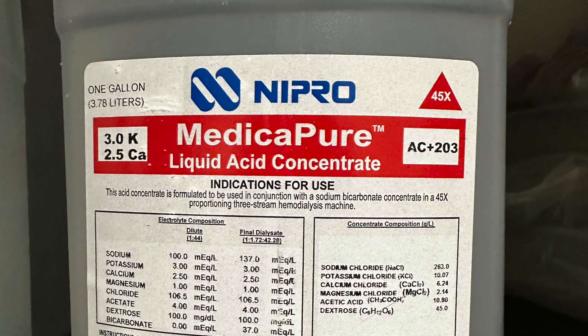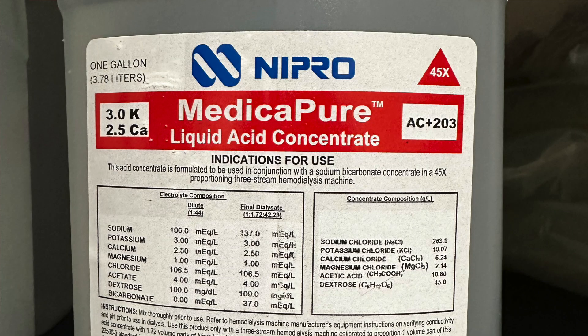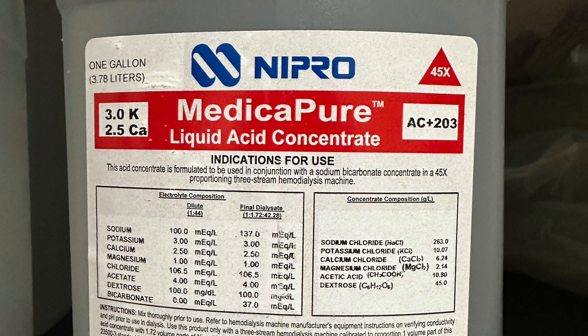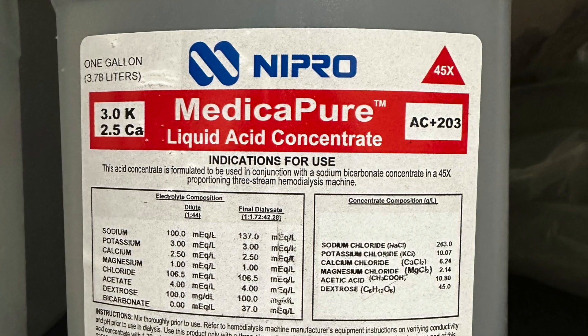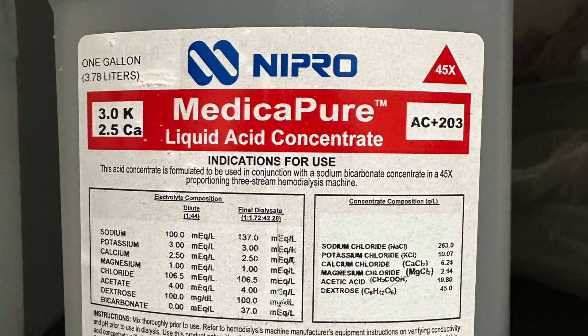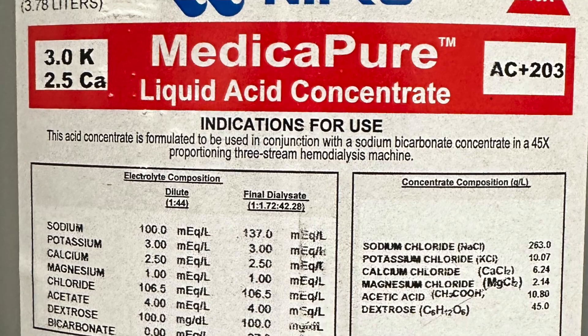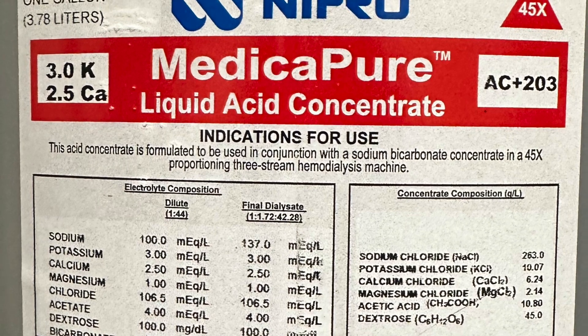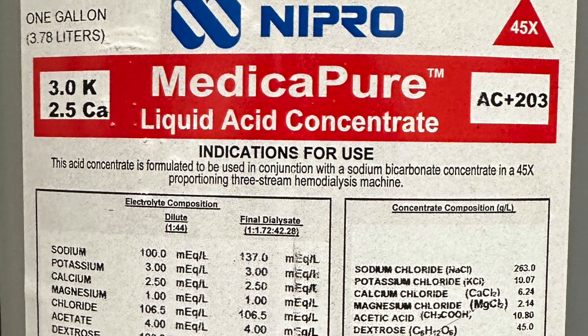The top left says one gallon or 3.7 liters. My initial thought is how does one gallon last through a whole dialysis treatment when we're doing 600 mils per minute? We'll find our answers as we go on. Next: 45X — I don't know what that means yet. Then 3K, 2.5 calcium — it means three potassium, 2.5 calcium. This acid concentrate is formulated to be used with a sodium bicarbonate concentrate in a 45X proportioning three-stream hemodialysis machine.